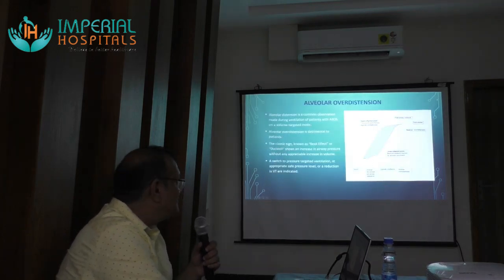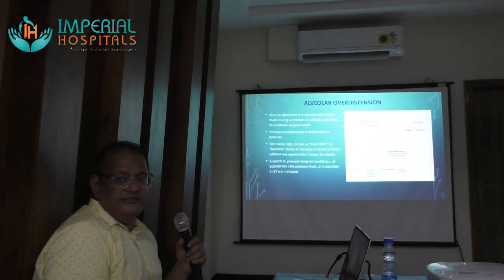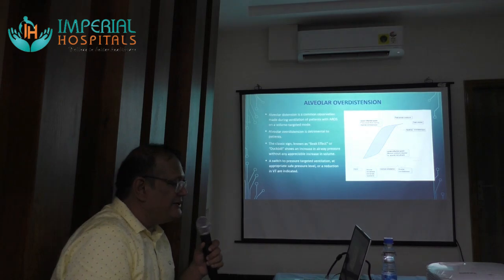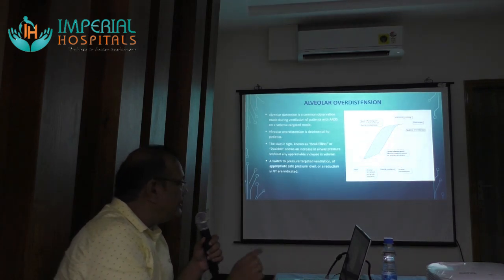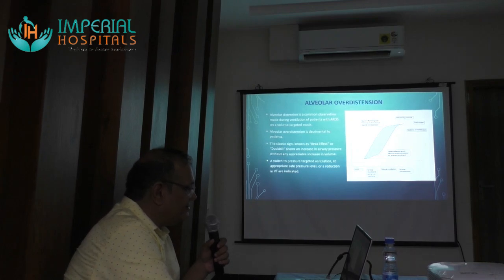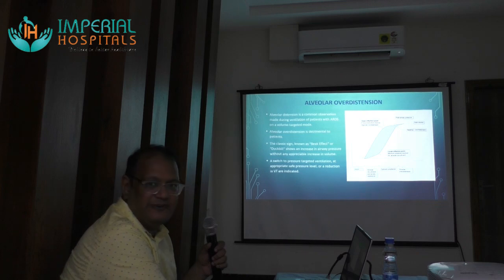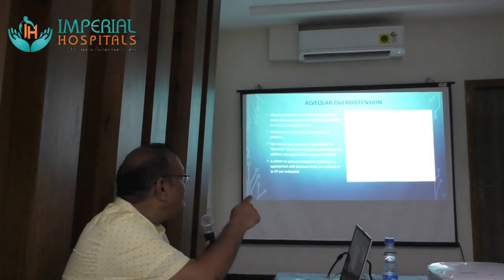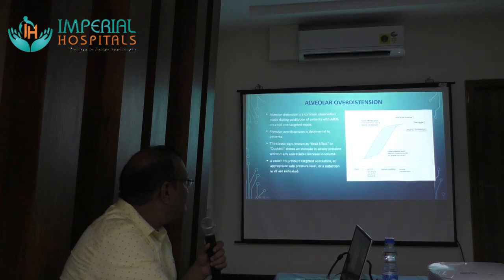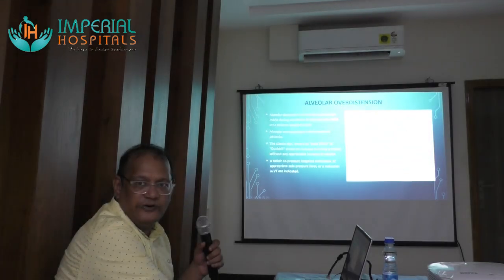Alveolar over-distension is one of the important points. We look for the beak effect at the end of the inspiratory phase. You see a sudden beaking sign there. That means there is an increase in airway pressure without any appreciable change in the volume being delivered. Up to the beaking, where it's marked, from here till here, the volume delivered has increased very little, but the pressure has increased a lot. So this means there is alveolar over-distension.